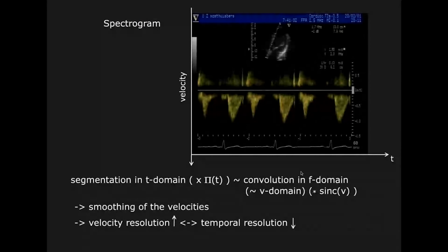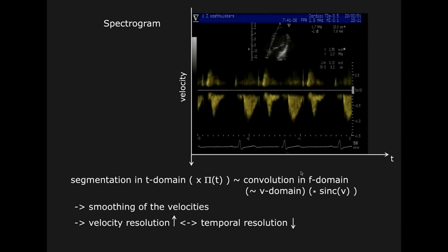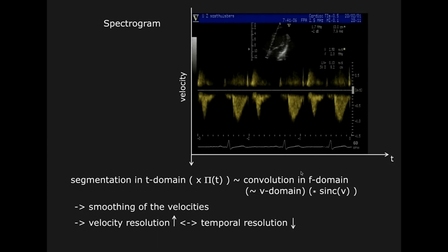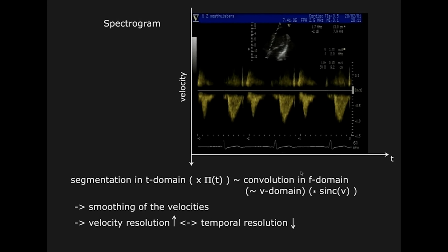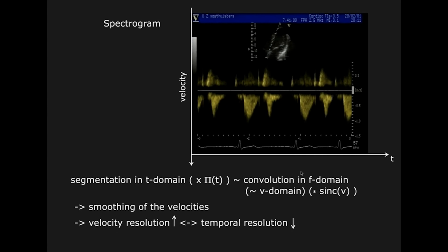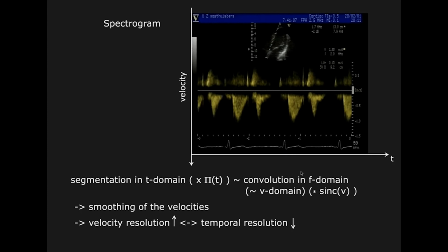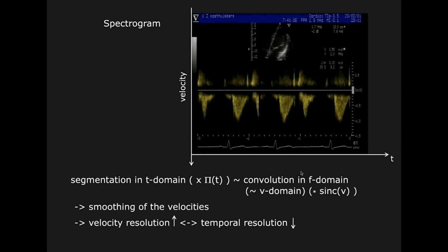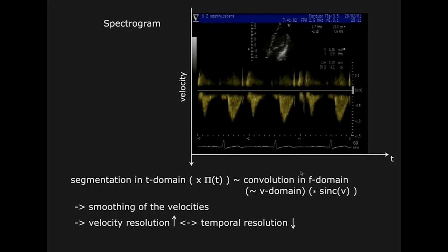And I show you here an example. This type of continuous wave Doppler is specifically used to measure high velocities of blood. When we measure in the heart, for example, we know that the highest velocities of blood are within the valves of the heart. So if we make a scan line through the heart, and we know that we go through the valve, we know that the highest velocities on the scan line will for sure come from the valve, because of the anatomy, because of the physics. So it still can contain information.